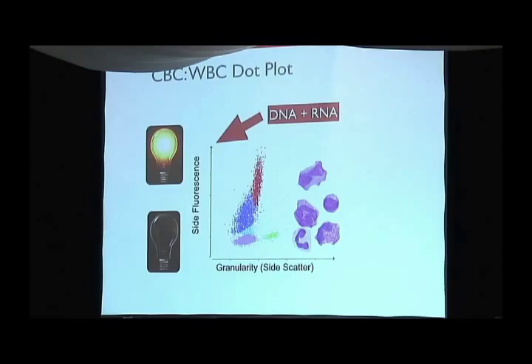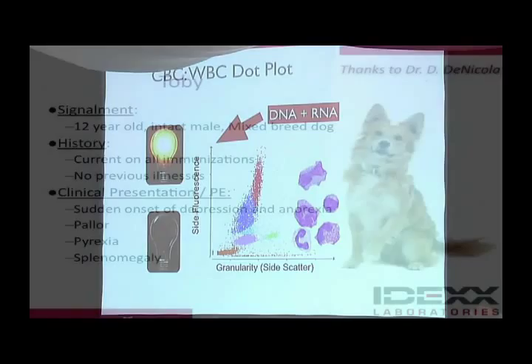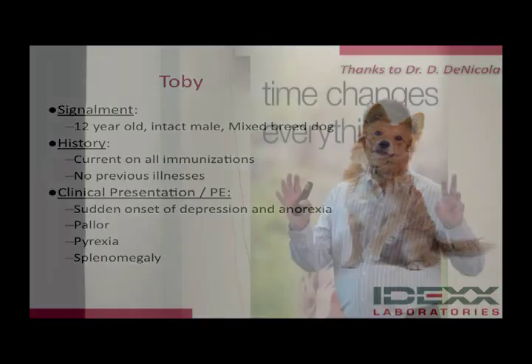So remember, we did a red cell run first, now we're doing a white cell run, and there are some little chunkies of red cells left behind. So in orange, you see those little pieces of red cells that are not completely lysed. So this is a normal leukogram or leukocyte dot plot. I'm going to show you this one next to the abnormal ones, and now I'm going to show you some cases. And you guys survived all the technical slides, so I'm very proud of you.